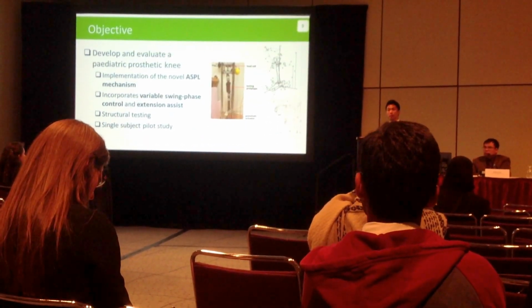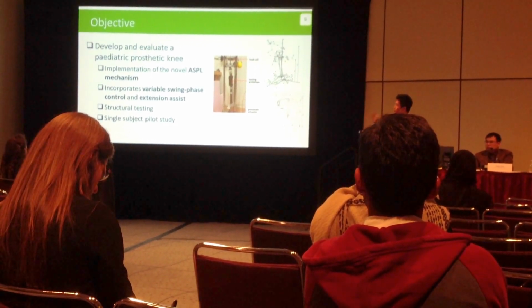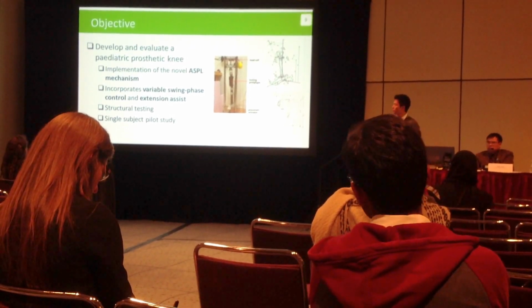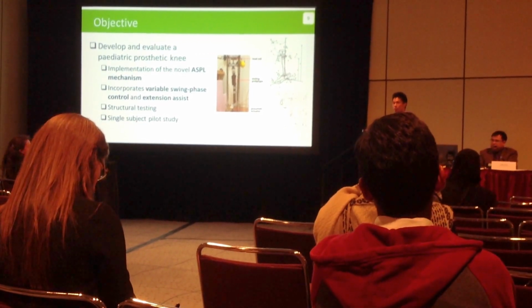So the objective of my project is to design and evaluate a pediatric prosthetic knee using the novel ASPL mechanism, as well as incorporating variable swing phase control and extension assist. And after that, we're going to conduct structural testing and a single subject pilot study.